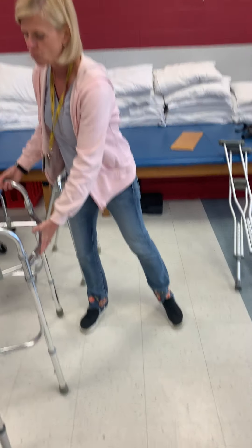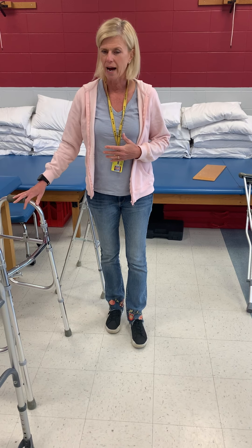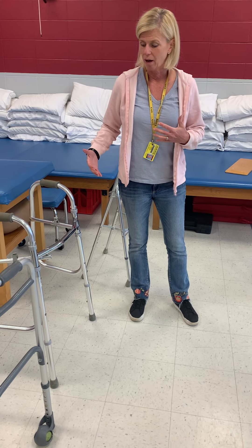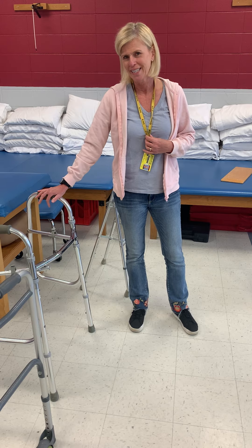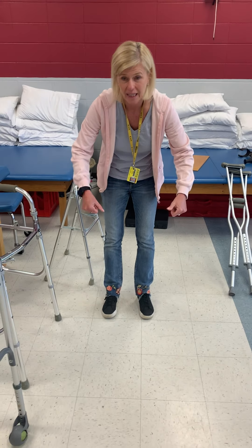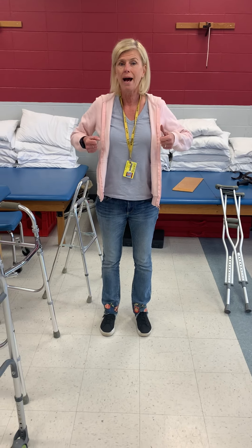A lot of patients will go out and buy their own walker or get one issued from the doctor, and adjusting a walker just isn't their forte. You may see a lot of walkers that are too high or too low for a patient, and it makes a huge difference. If it's too low, they're going to have posture problems — they'll be leaning over in that walker, which is never good. And if it's too high, they don't really get the stability they need either.